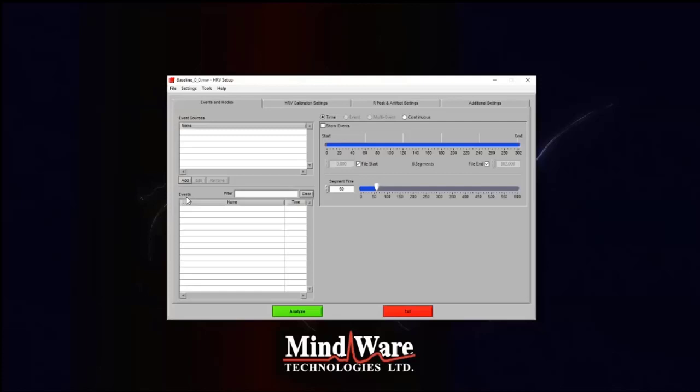In addition to that, just due to the time limitations of the study and the scope of it, we're not going to go through every single setting here and how to sort events and things like that. We're really going to focus on the actual data and how we clean it. We do have plans in the near future to provide a comprehensive guide on what every setting should be. But as I'll also cover later, we do provide complimentary one-on-one consultations. So that might also be a better use to get the exact answers for your specific study and your specific research questions.